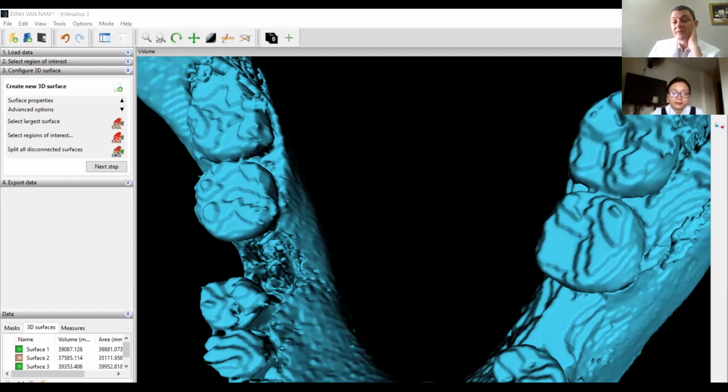You cannot distalize the 7. It's very limited. Usually you have 2-3 millimeter if you are lucky, but I had case where I had 0 millimeter.